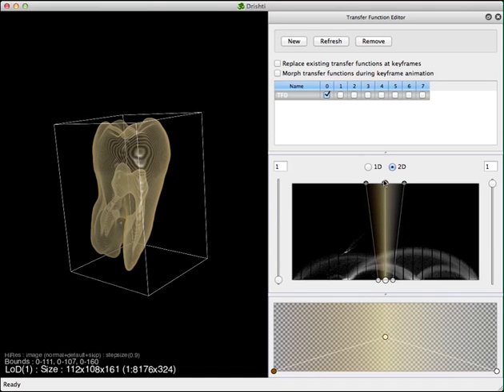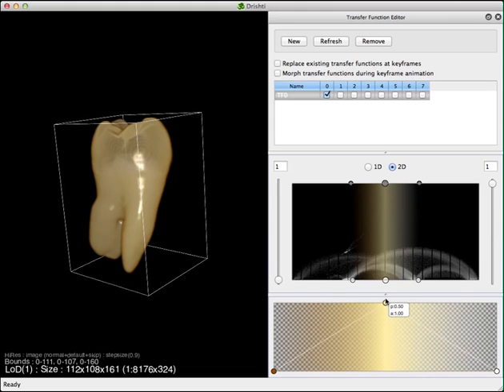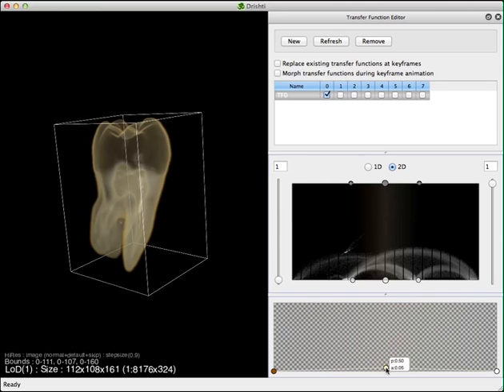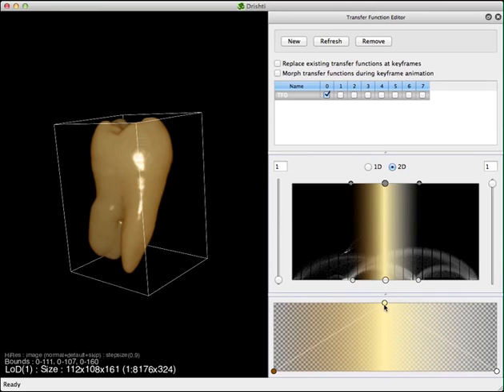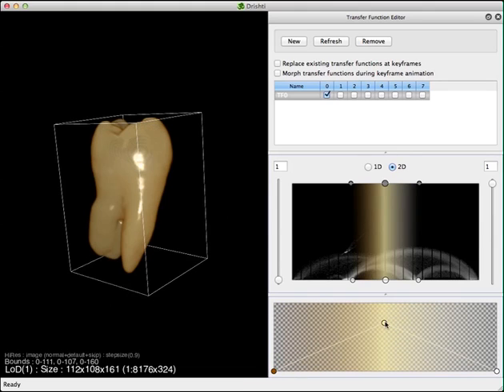Let me show you what these numbers really mean. I'll make this bigger so it's easier to see, and I'll also increase the opacity. Moving this up and down changes the opacity of the transfer function — moving it down gives low opacity, moving it up gives high opacity.